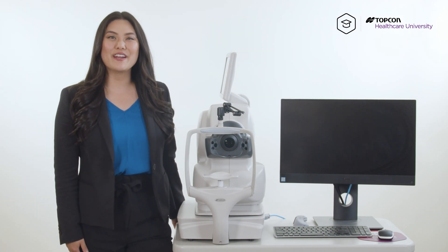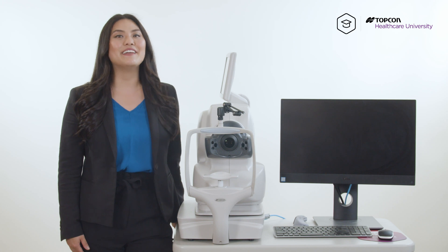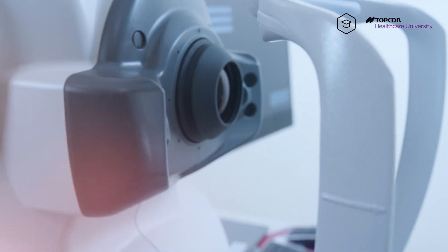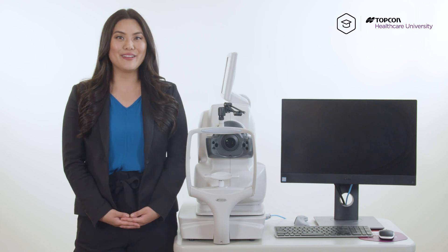Hi, I'm Candice, global trainer for Topcon Healthcare, and today I will be showing you how to properly align your 3D disc scan using your Maestro 2. It's important for your optic disc to be properly aligned, otherwise it can impair the results of your scan.